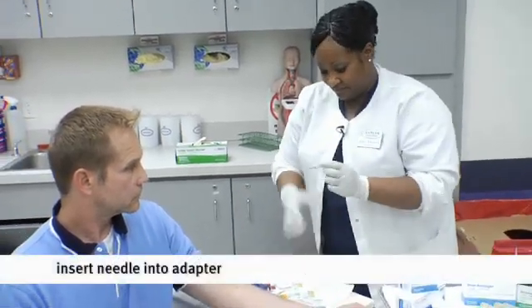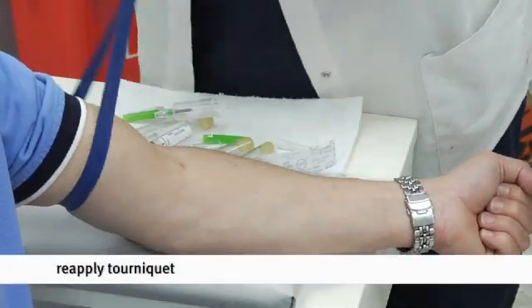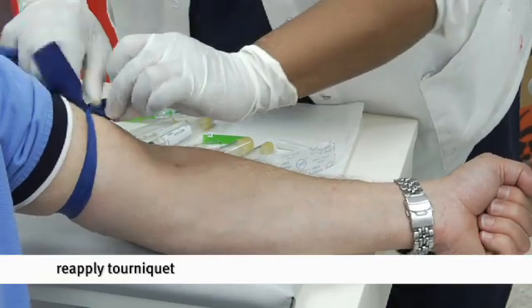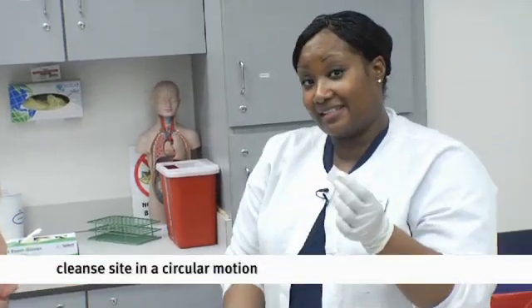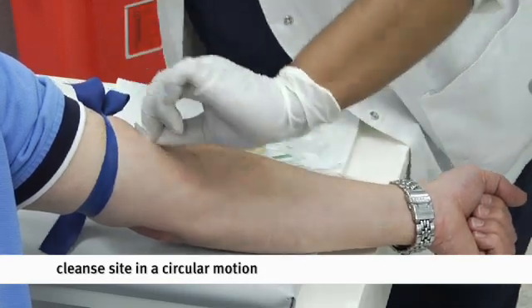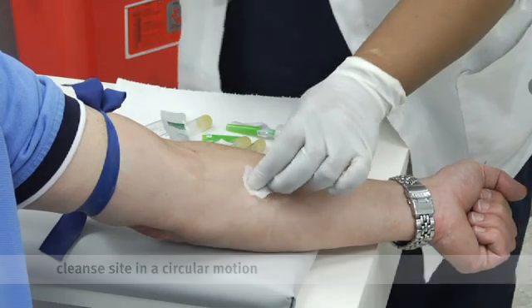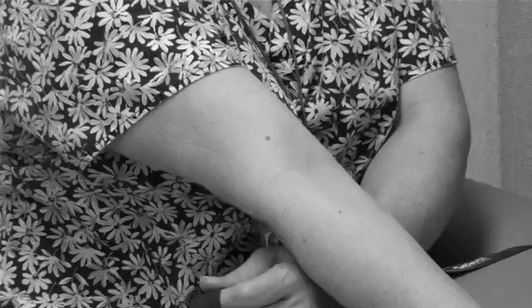Make sure you have your equipment assembled before you begin the procedure. Insert the needle into the adapter and you're ready to go. Next, cleanse the site in a circular motion — you're taking all of the germs away from the site, starting from the inside out. Let it dry for a little bit. You have to allow your area to dry, because if you stick your patient with the alcohol still wet, not only is it going to cause burning, but it can also cause inaccurate test results. Try your best not to make your patient nervous.